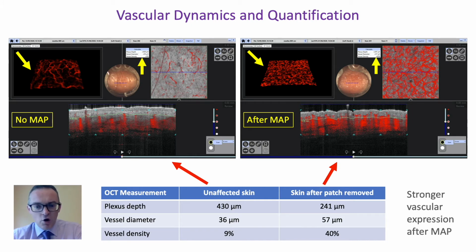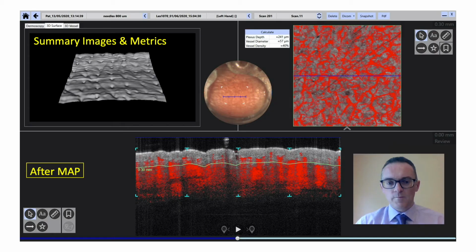What is really important is that we can use optical coherence tomography to show that this increase in local blood flow, or erythema, resolves quite quickly, and that if we came along the next day, we wouldn't be able to see any erythema. This is an important indication that microneedles are a safe delivery system, and we can use a quantitative technique to follow that.